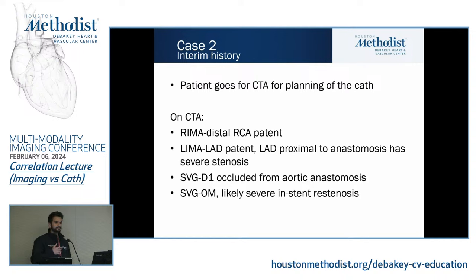I think before this, when I had spoken to the primary cardiologist, the thought was that if the CTA was not done, they would have had to think about, okay, are they going for a LIMA lesion, and do they have to plan the cath with backup, specifically like an Impella. This was, again, thought process, not what ended up happening, but it's food for thought. These are the cases where maybe you have to think before you go into the cath.